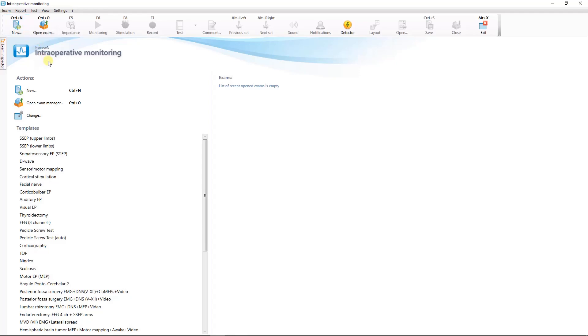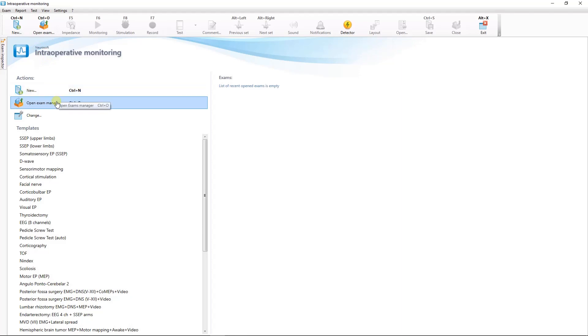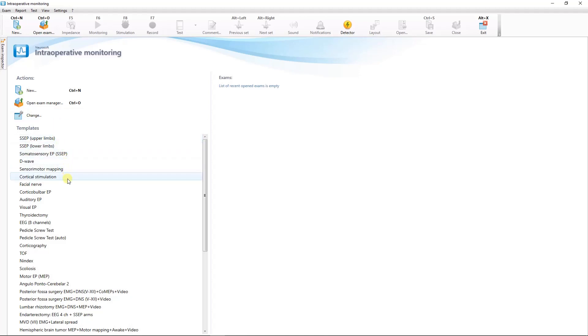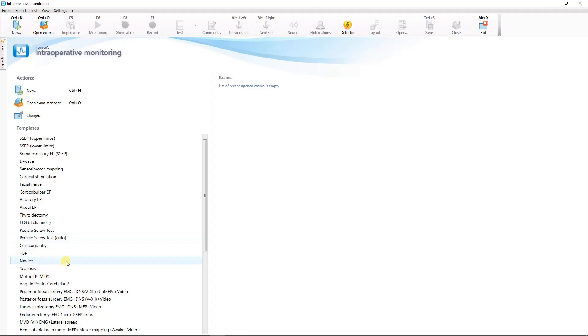On the left side you will find buttons to start a new exam, open the recording data with the exam manager and change the software settings. Below is the list of test templates for different types of surgeries. To quickly start a new examination simply click on the name of the corresponding test.